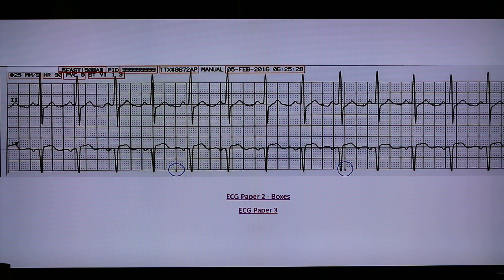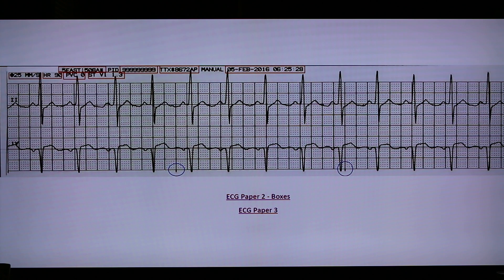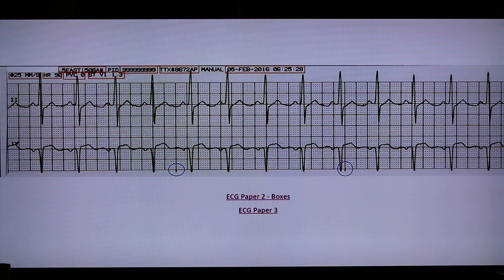Not all telemetry systems will display all the data, but most basic data will be displayed. The usual default lead is Lead 2 and V1, but you can change it. The tiny lines circled here are 3-second markers. This means from the beginning of the strip to the line is 3 seconds, and after that is 6 seconds and so on. The 6-second marker is important in computing for heart rates.